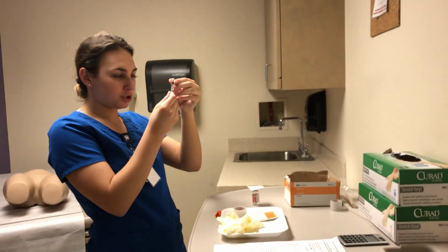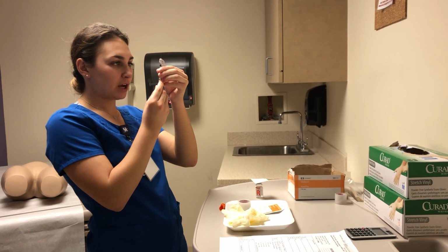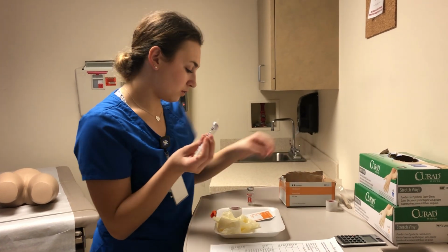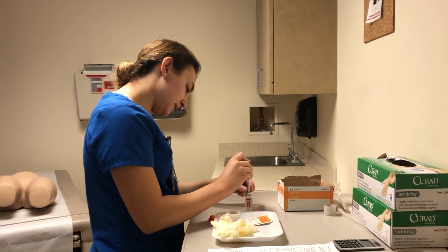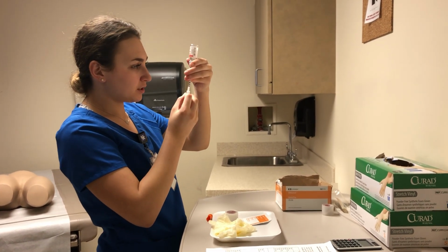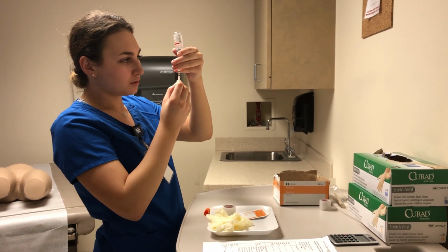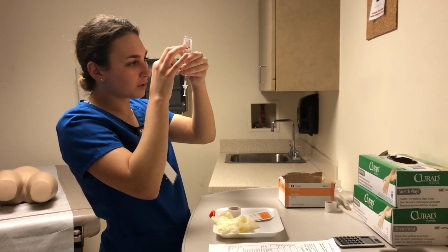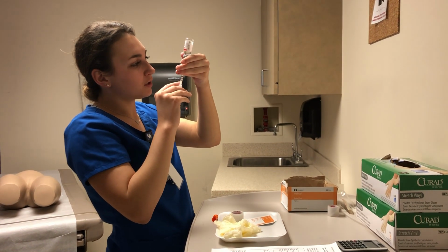and I am going to pull up 6 units of air into the syringe to inject into my medication. Okay, taking the alcohol wipe off. Needle is going in. I'm injecting my 6 units of air. My needle is below the water line, so it's okay for me to pull up the medication. I'm overshooting so that my air bubbles will not get in.